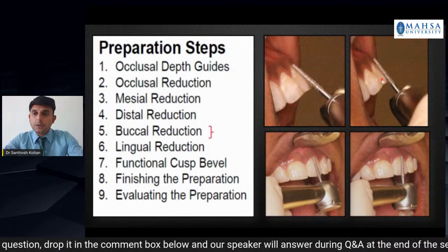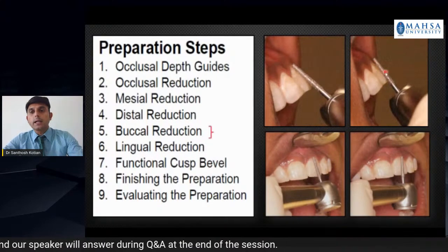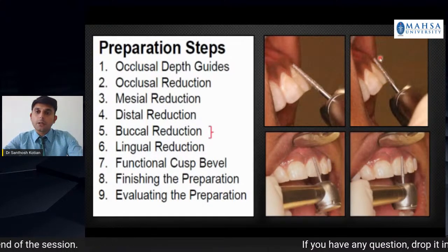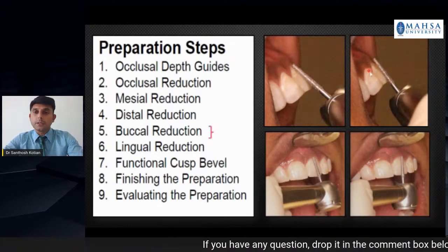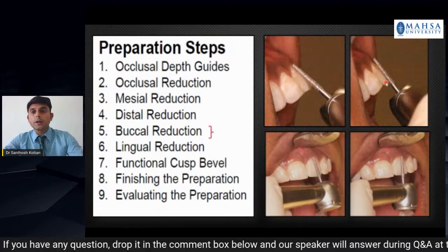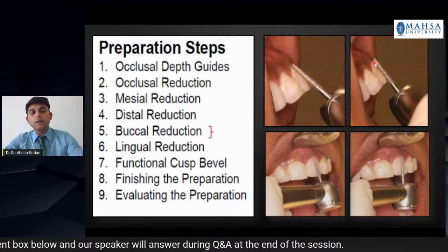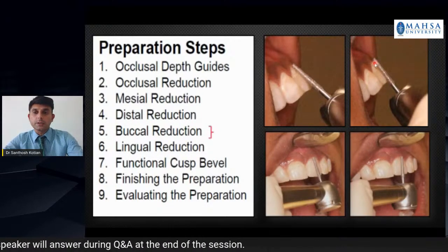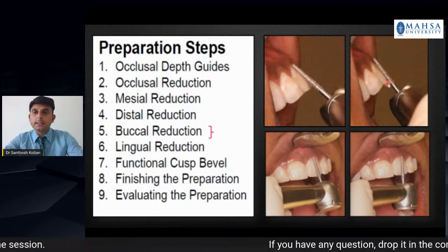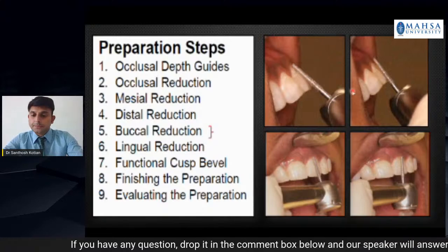The entire design of the burr, from the tip towards the body, is designed for how your tooth preparation should be. This tip area of the burr is designed for the cervical area of the tooth, and this body area of the burr is designed for the incisal area of the tooth. So do not change that. Once you do change that, the final design of your tooth prep also changes. So always maintain this position. If you want to prepare the incisal surface, use this part of the burr and not the tip of the burr.